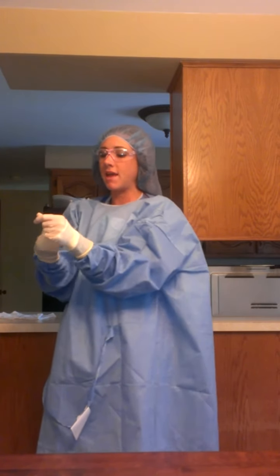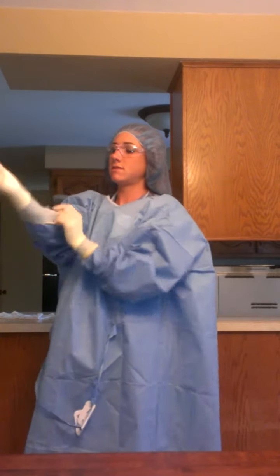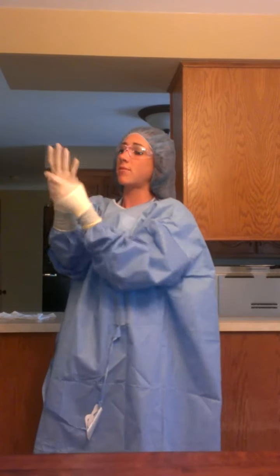Now when the surgeon and the first assistant, anybody in a sterile role, I'm the first one in the operating room. So when the surgeon is ready to come in, I am going to assist him or her in putting on their gown and gloves. So we've got this set here. If something were to happen, if I were to get a rip in my gloves, my hand were to come through, I would need to make sure to change that, to fix that error, to go back, start over, and redo it. So once we are gowned and gloved, I am completely sterile.